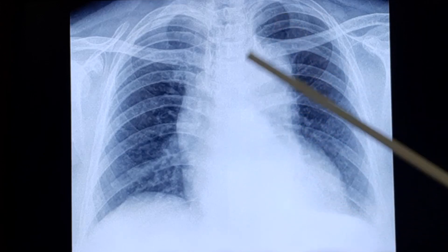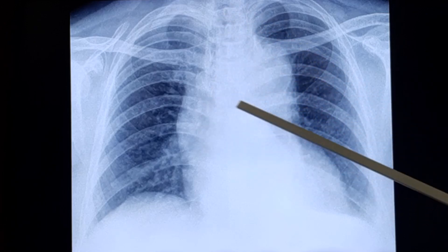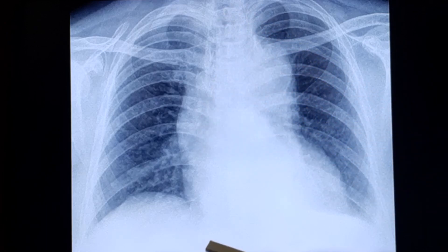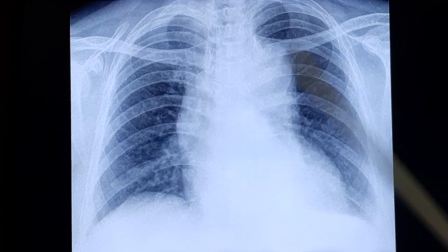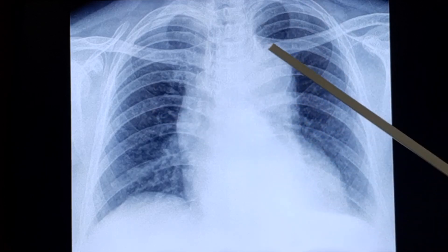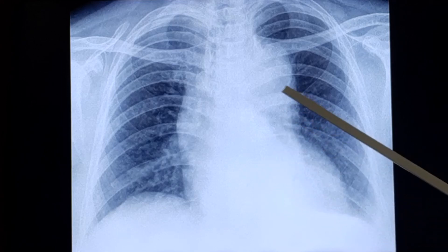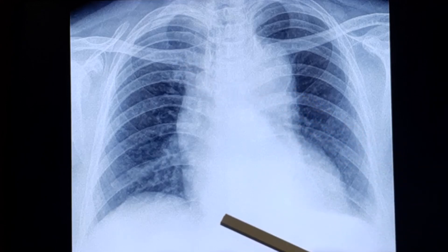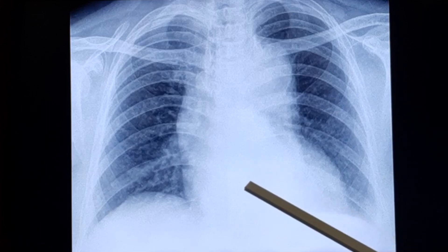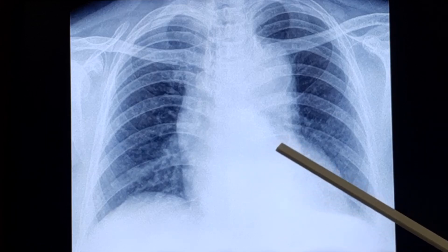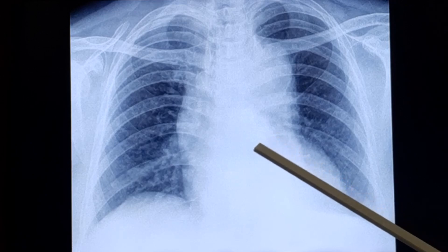This is a good x-ray because you can see the tracheal air shadow, the bronchial column, and the lung fields are all seen very well technically. Mediastinal widening is seen, and when mediastinal widening is seen, the first possibility in a person with left scapular region pain is of course dissection of the aorta.